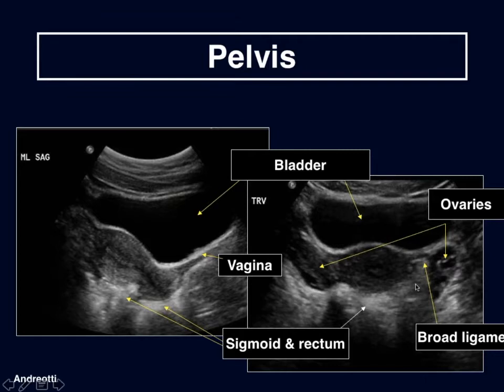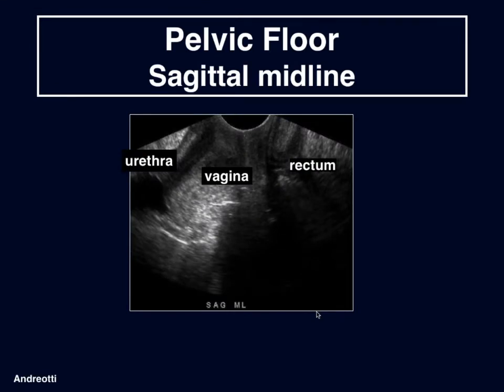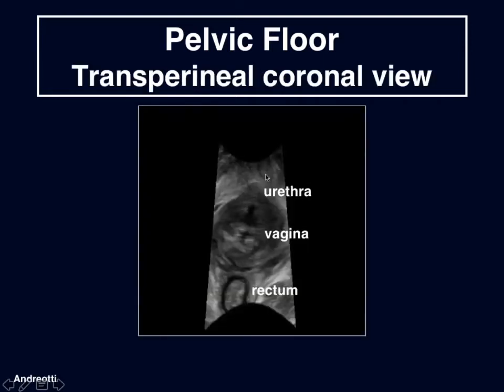We can see the ovaries on either side with little tiny follicles that helped us to know that these are truly the ovaries. We can also use ultrasound to look at the pelvic floor and see the normal anatomy — the relationship of the urethra, vagina, and rectum in the sagittal plane. And then here, we can even see the relationships in the coronal plane by doing a transperineal evaluation of the pelvic floor.